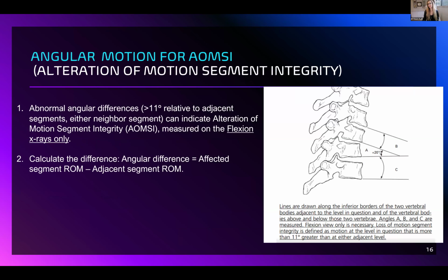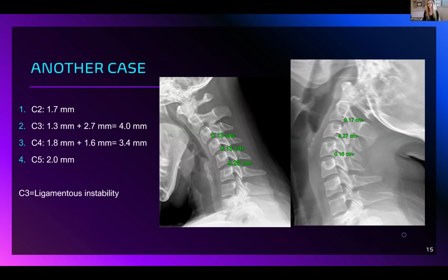Okay, gotcha. One thing I know here that I've seen on some that I don't see on others, if we go back to that one slide, is I had a question about that. You see up here, this looks to me more like a female spine, just from the view, but I could be wrong. But you see how on extension you have the occiput touching here, and it's not like that on everybody. Some people have that.